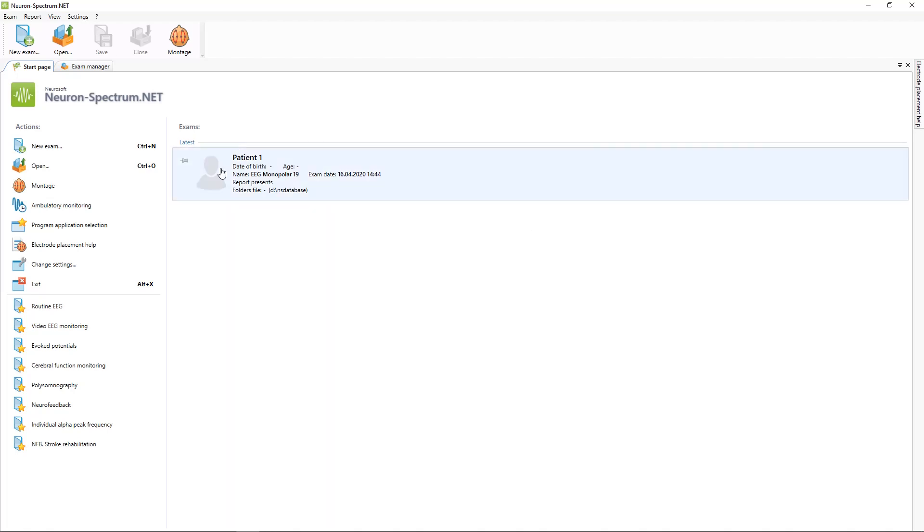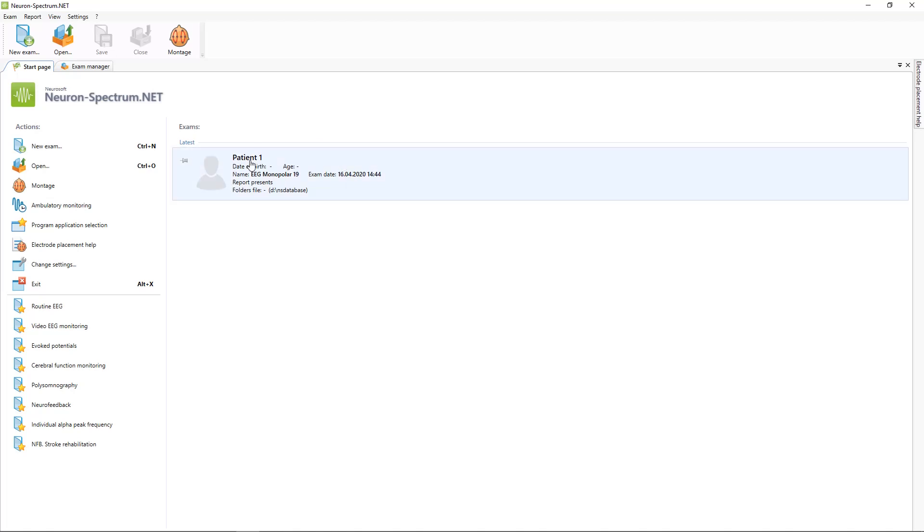Now you can see our last recorded examination directly on the start page. Here you will see the list of all your patients.